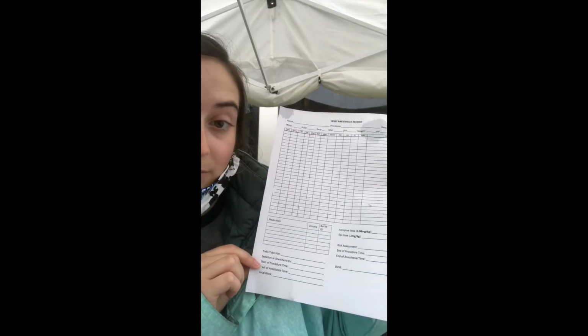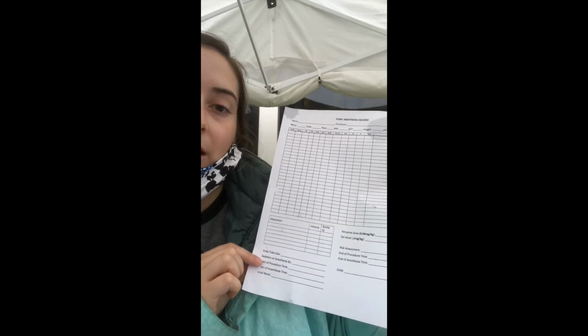Over here we have the ET tube size, who calculated the anesthesia or sedation, the start of the procedure time, the start of the actual anesthesia time. So the procedure maybe starts 5 to 10 minutes after we actually induce. That gives us a range of time between when the patient is actually induced under gas anesthesia and IV anesthesia, and then when the doctor actually makes the first cut.